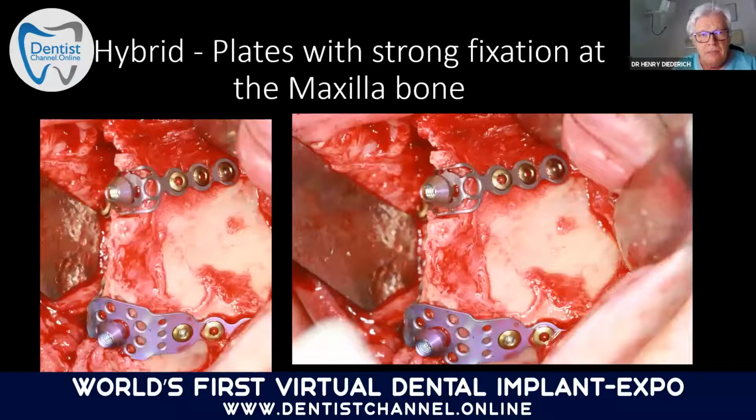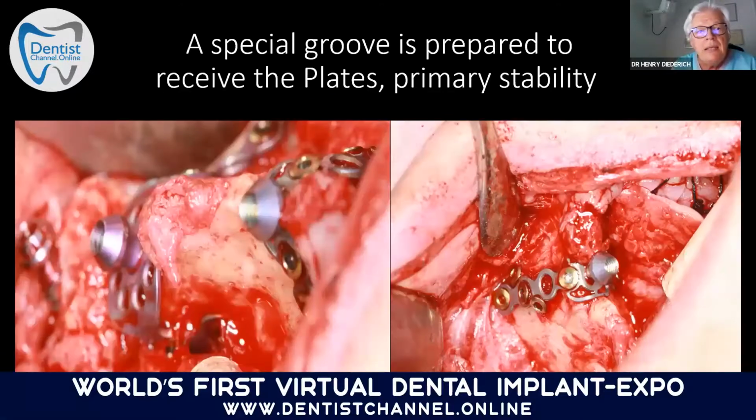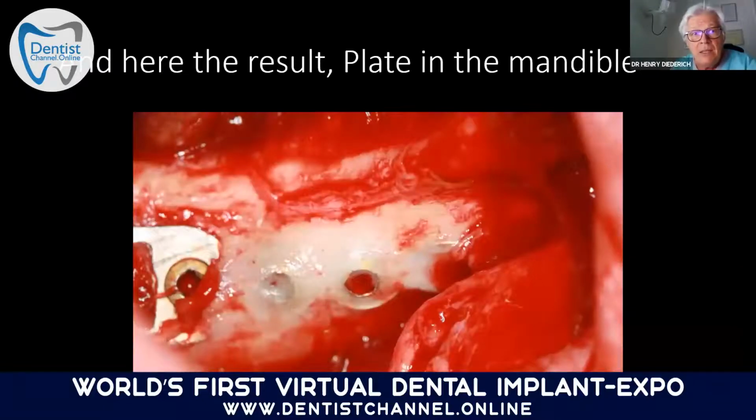Another time, the hybrid plates, they are fixed here in the maxilla bone. And here, another view. See on your left side, a special bed is prepared to receive these plates. And then what happens? That is so wonderful about this, what nature is doing. Bone is growing over this plate.